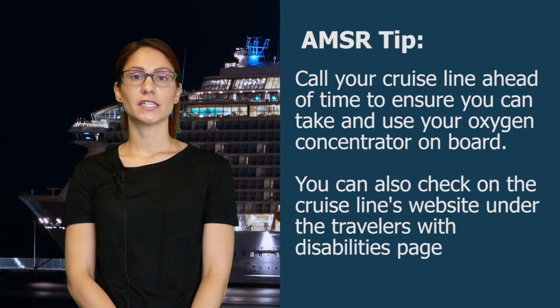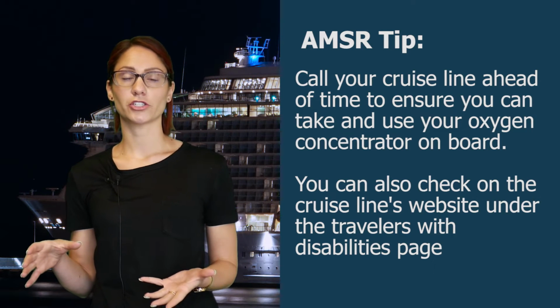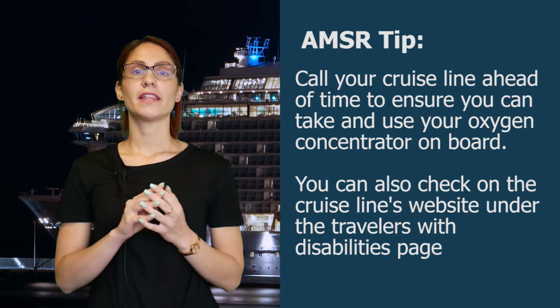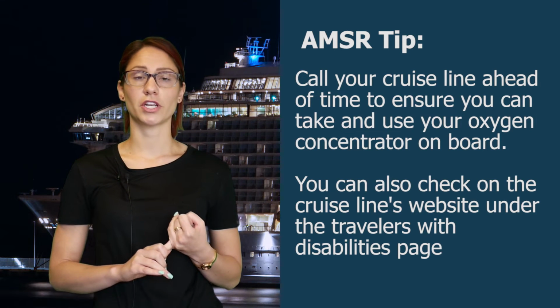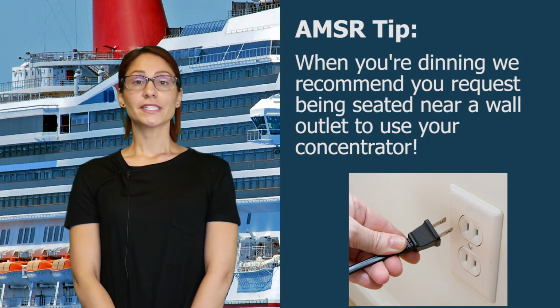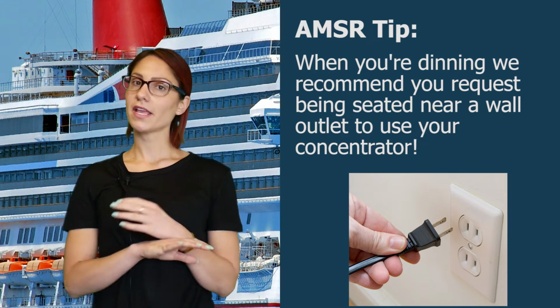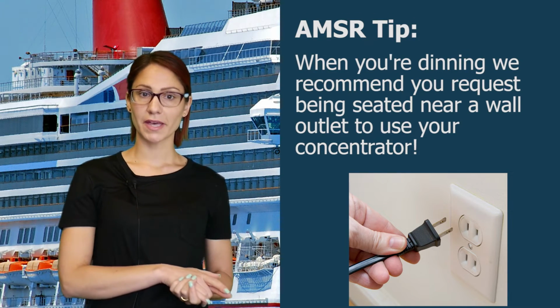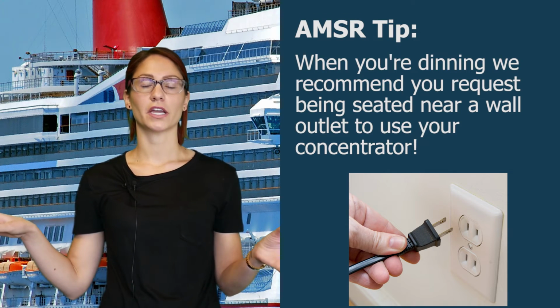And while some cruise lines are very relaxed about traveling with oxygen, others are not, so make sure you get all of that information. They may require a doctor's prescription or medical order for oxygen and some details about your diagnosis. So just like at home, you can plug in your portable oxygen concentrator to any available outlet on the cruise ship. You'll have some in your cabin, you'll have some out and about when you're walking around.